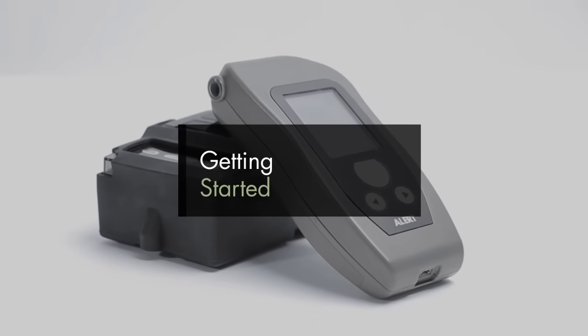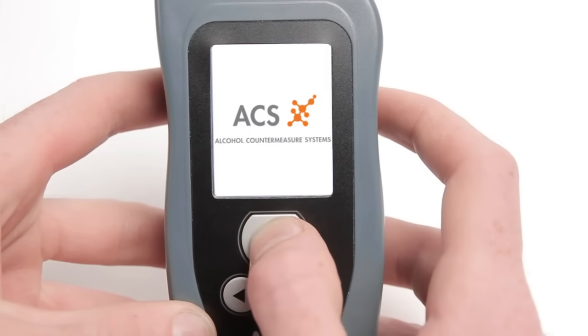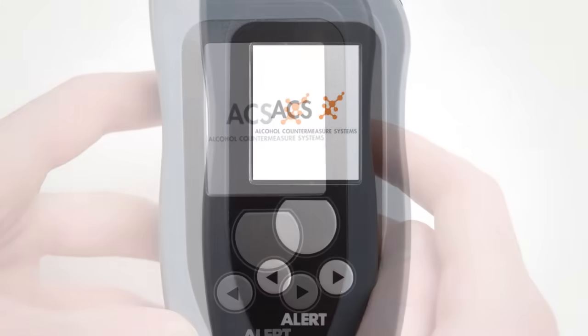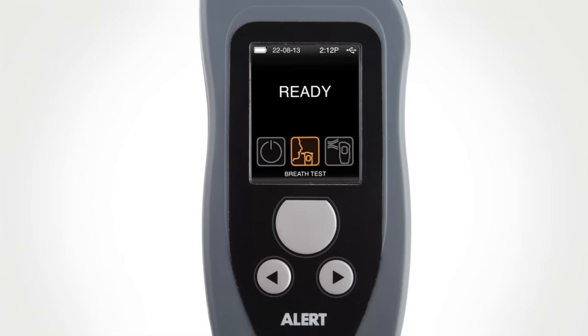Getting Started. Press the main button once to power on the Alert J5 Evidential Breath Alcohol Tester. The ACS logo is displayed during the startup sequence. Ready appears on the display when the Alert J5 Tester is ready for use.